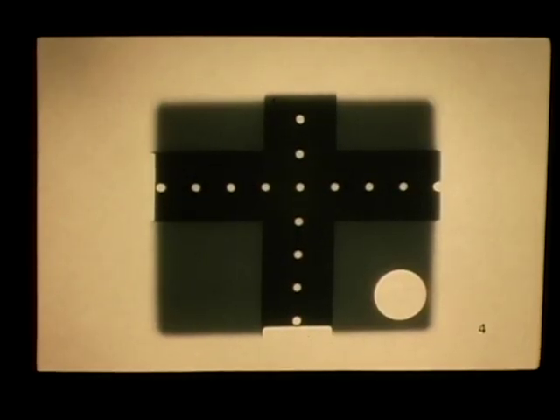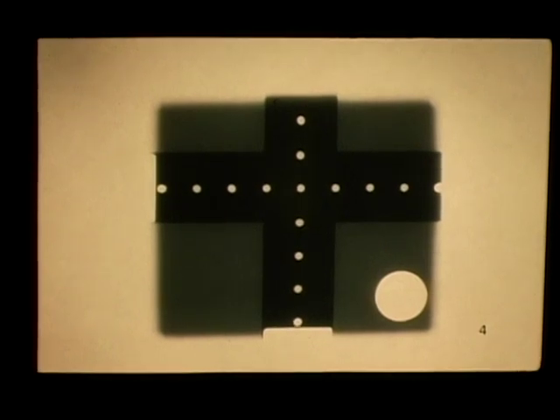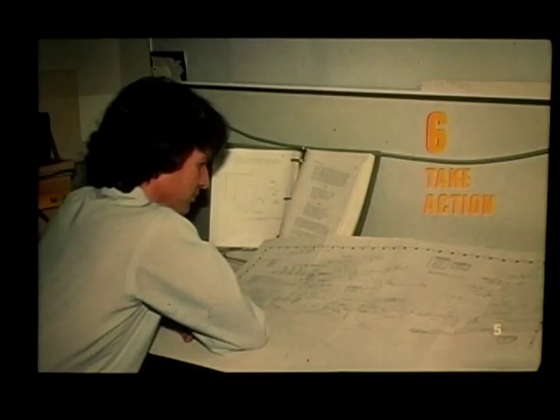Number 4. If any of the quality control tests performed in Step 5 provide data that does not meet the established equipment specifications, then adjustments or repairs need to be made. For example, an adjustment is required if the collimator light and the X-ray beam are more than 1 centimeter out of alignment at a 40-inch target film distance.